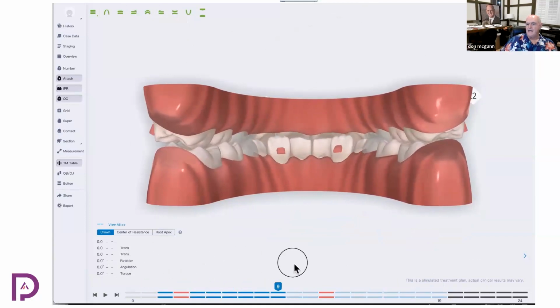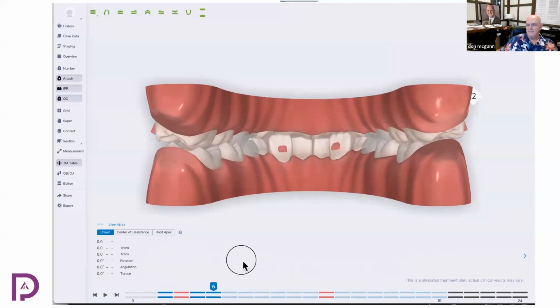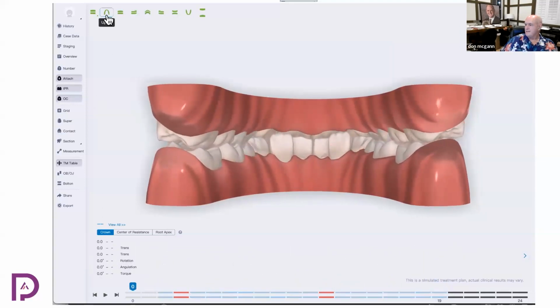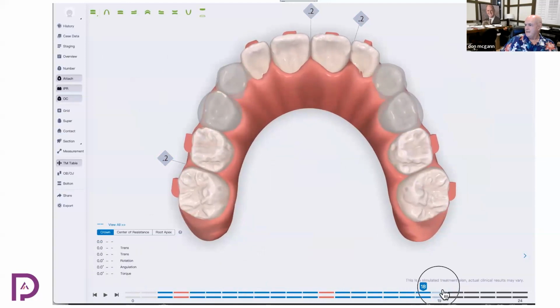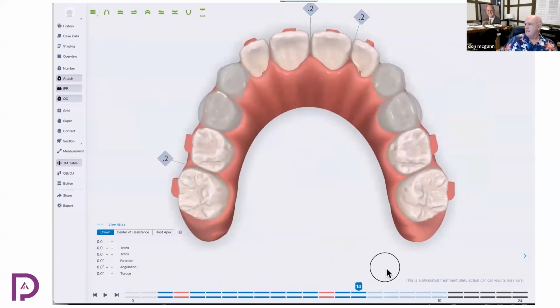Now, are you going to get 100% of what you see? Absolutely not. You'll get somewhere around 70%. In some movements, maybe 50, okay? So again, things that are annoying, like the deep bite, well, do it now.